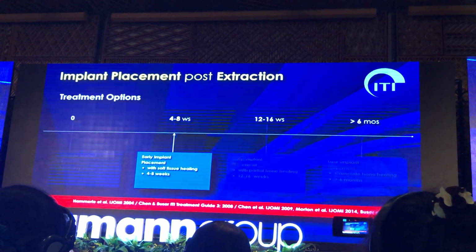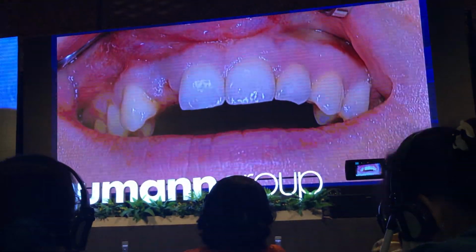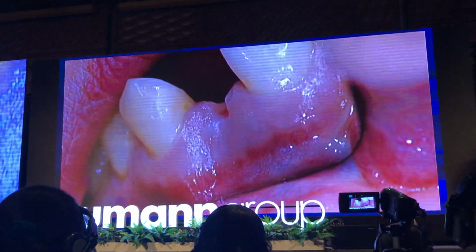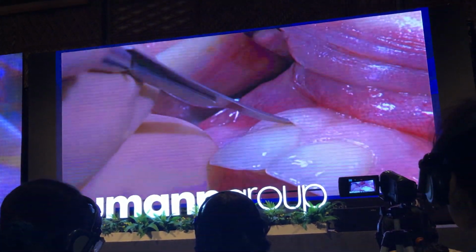Now when we go back to early placement in aesthetic sites, I have put together a video clip. Now let's see, can you give me the sound? Because it has a sound. I want to show you this in detail.